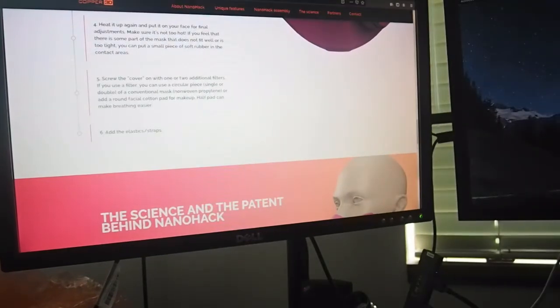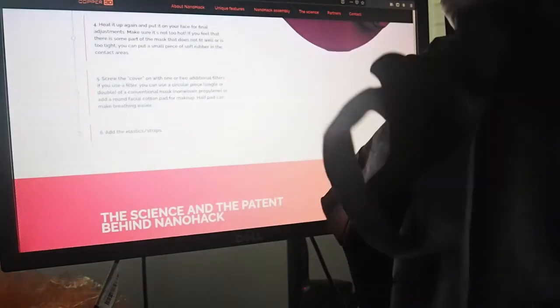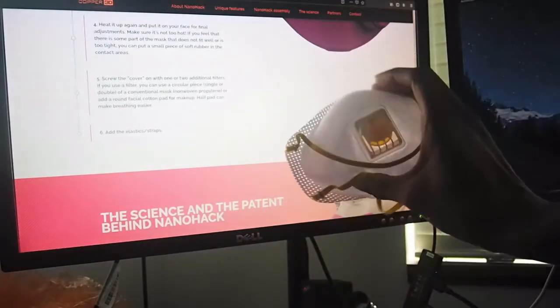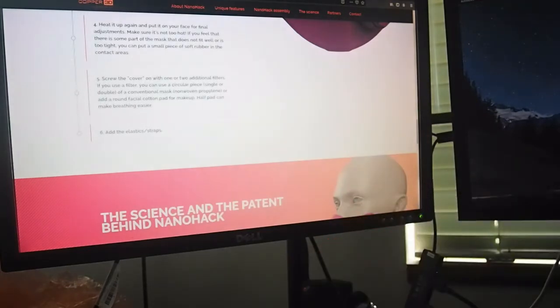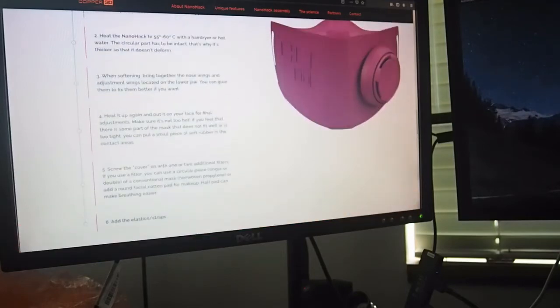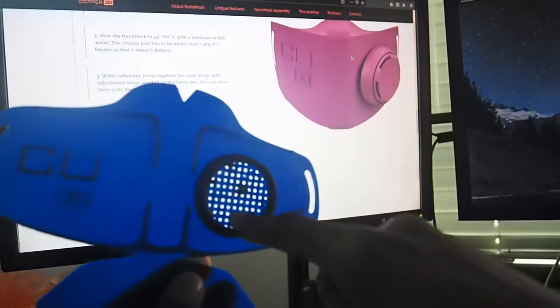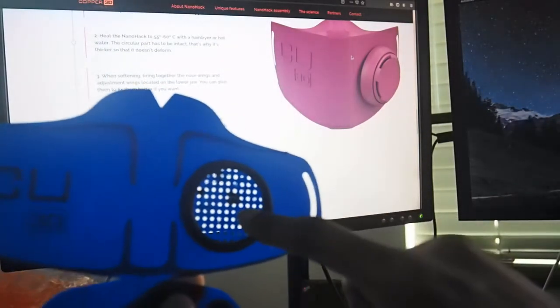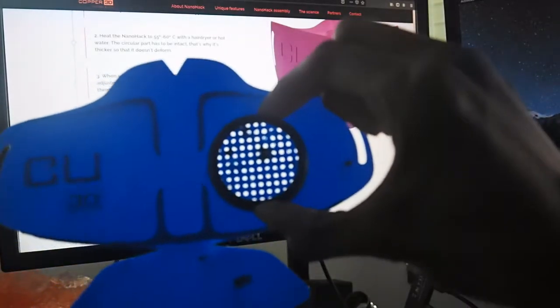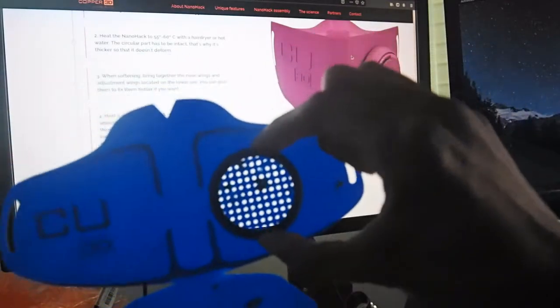Alright, so you're going to want to try to find one of these non-woven bags. This one's actually not the right type of material, but if you get the right thing, it's got a similar effectiveness to one of these disposable N95s. So you'll end up cutting that material and then placing it in the filter hole. So you've got a nice little filter hole right here. You put your material, any filter material. You can use just about anything, but you really want, if you can find it, a non-woven fabric. I forget the exact type of fabric, but it's basically some sort of poly blend.